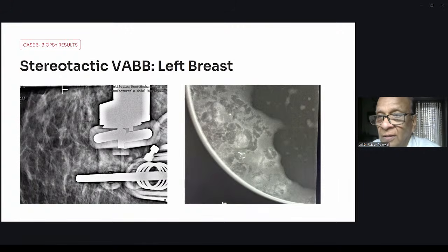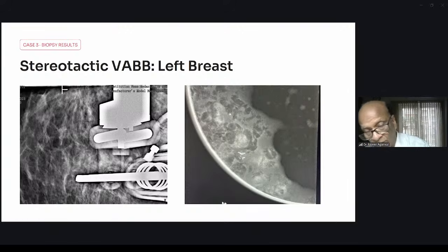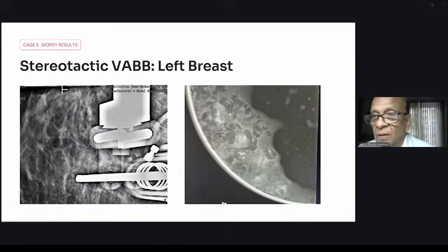That's always a rule of thumb that for all microcalcification, we must do a specimen mammogram, whether it is the core or the vacuum assisted. Not only that, if wide local excision, as Anupama said, even if we have to do wire guided excision, we must do a mammogram of that specimen so that it corresponds to the findings on the original mammogram.